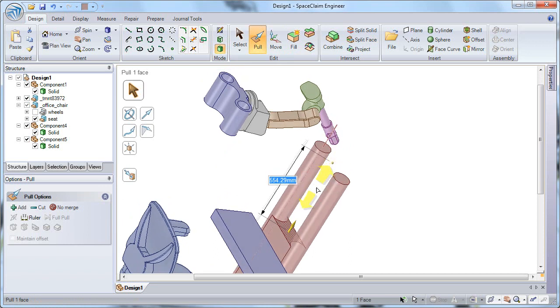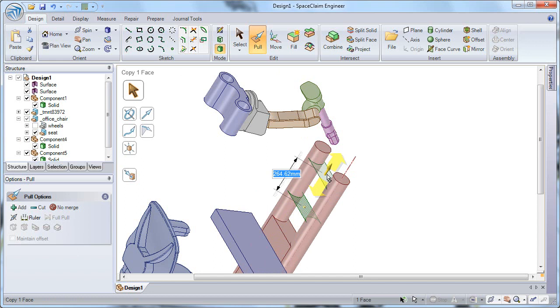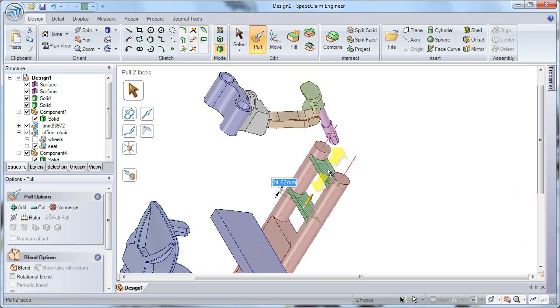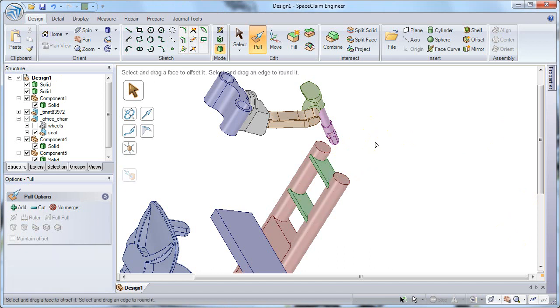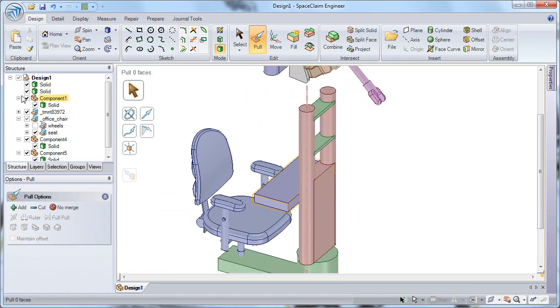So you'll notice that if I select on that face on my component and pull on it, it's going to pull on that geometry. But if I hold down Control and pull, it'll copy that face and give me a copied face, and I can copy that twice, holding down Control to create two new supports. Now if I Control select both of those faces, you'll see that by default it asks me to blend, but I can toggle that option off, and then I can pull those faces up to create solids. You'll notice in the structure tree that those two solids that I just created are represented at the top level, and so they were not created as part of that mount, but I can easily merge them together using the Combine tool.